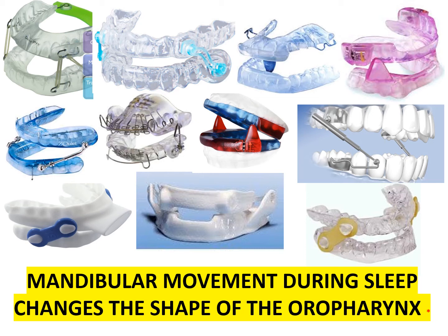Mandibular movement reduces that optimal size. Consciously choosing an appliance that enables mandibular movement is both contraindicated and poor clinical judgment. Remember, mandibular movement during sleep changes the shape of the oral pharynx.